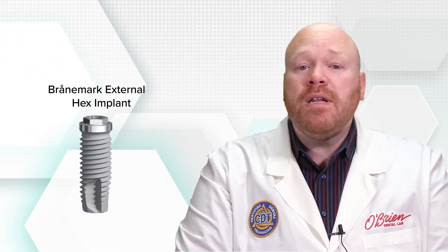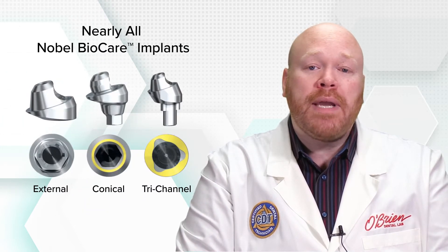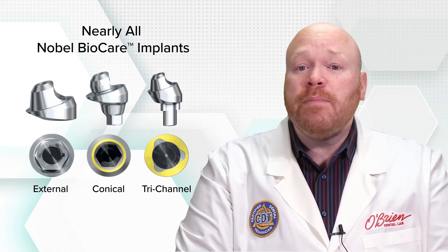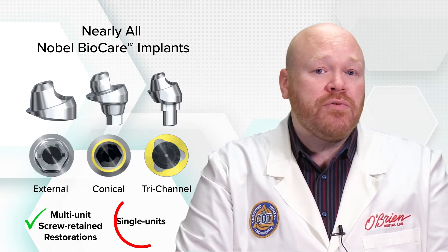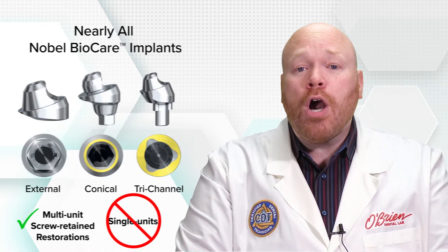Originally designed for the Branemark external hex, the multi-unit abutments are now available across nearly the entire line of Nobel BioCare implants. They're used for making multi-unit screw-retained restorations and are not indicated for single units. There are both straight and angled versions available, and they come in multiple margin heights as well.